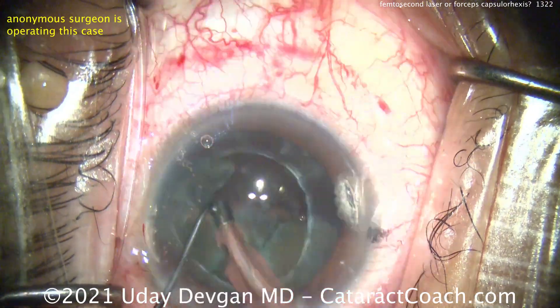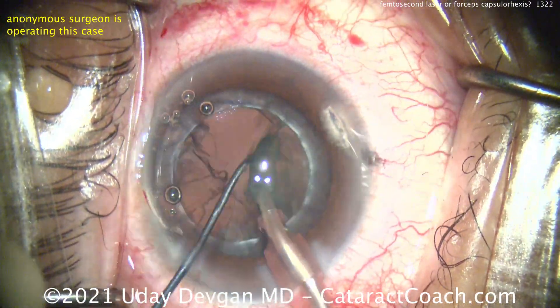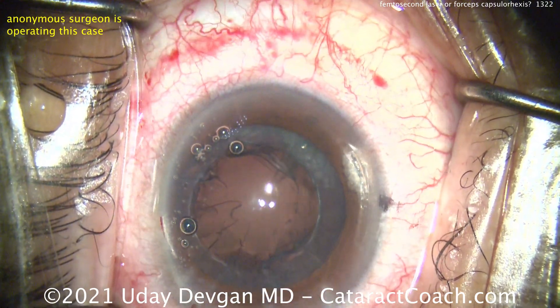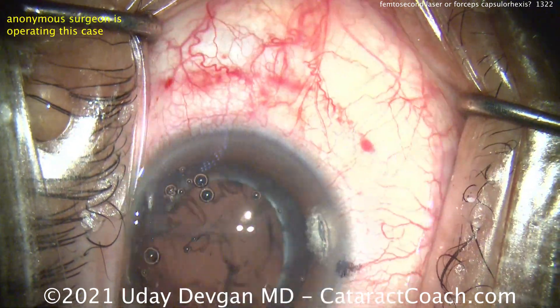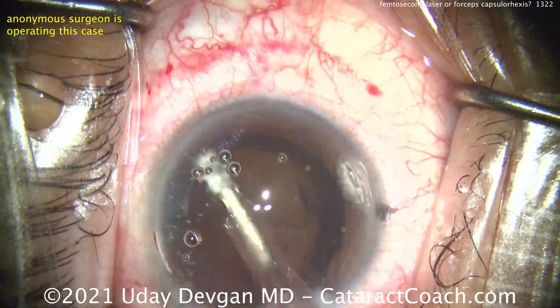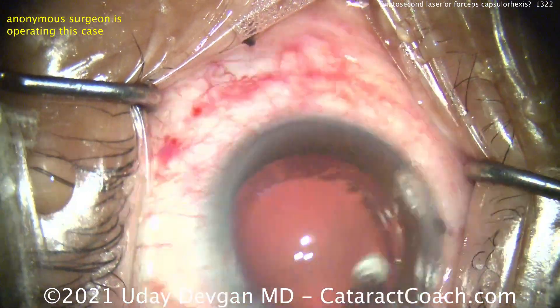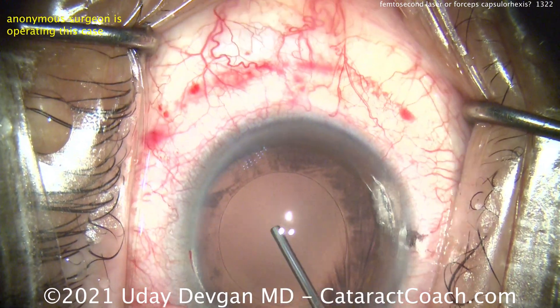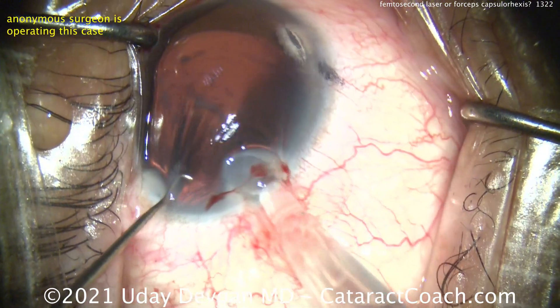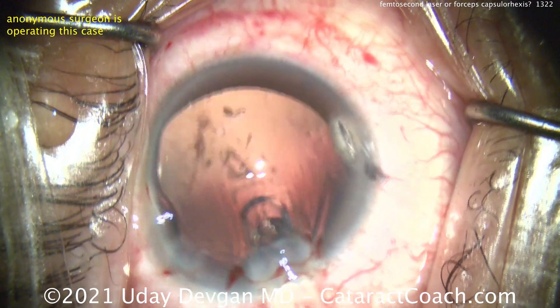All the pieces come out pretty easily, and there's the nucleus out as well. Now, if you look at the edge of the femtosecond laser capsulotomy — and it's not a capsulorrhexis because nothing was torn — it's a capsulotomy because it was cut whole. The way you do it with the femtosecond laser is thousands of tiny little laser spots all connected, so it looks kind of like the edge of a postage stamp.